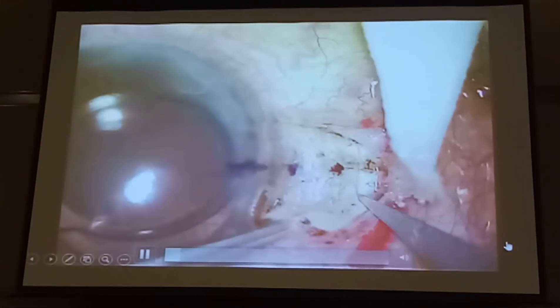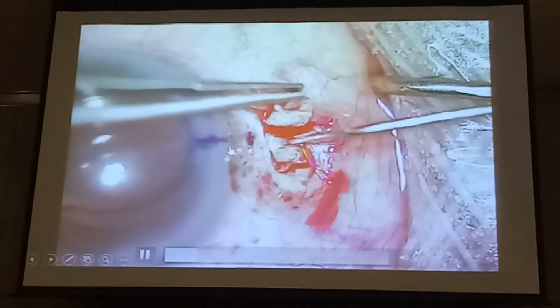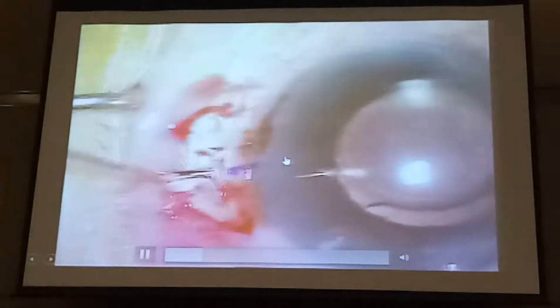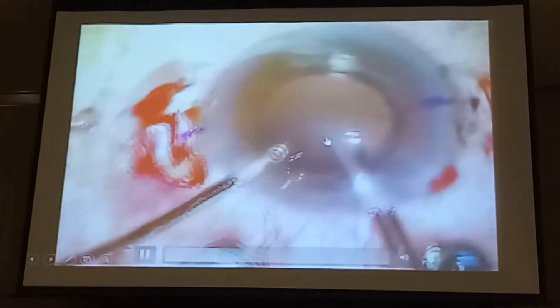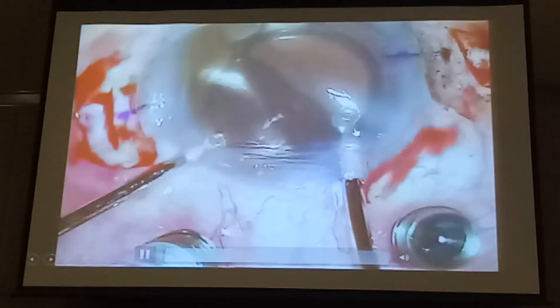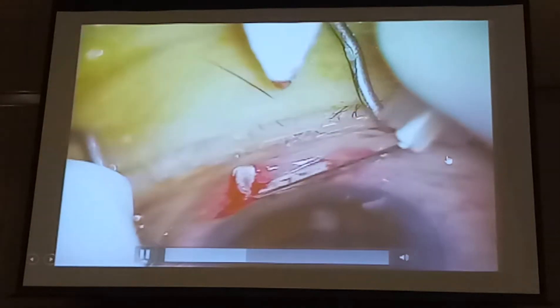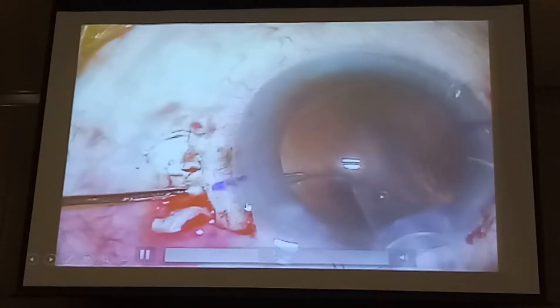I'm going to show you side-based flaps. This is what I published as a letter to the editor, because I had a case where with the standard flaps, when the haptic ran across the junction between the dissected and non-dissected sclera, it actually leaked, and I had to go back to the suture. So I thought: if I had a flap that covered the haptic as it ran across into the tunnel — from the sclerostomy across to the tunnel completely — then it's unlikely to leak.